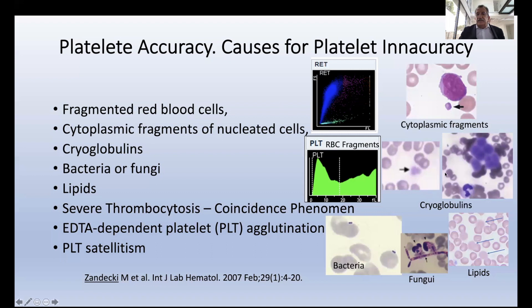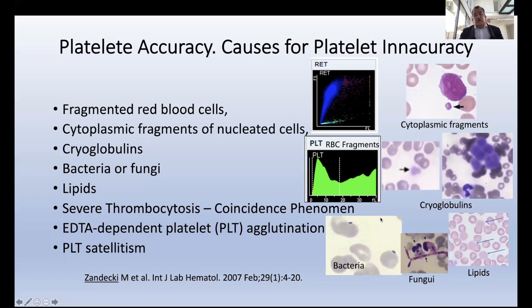Cryoglobulins can also interfere with the impedance count but not with optical platelets. Bacteria or fungi — you can see here diplococci that can be counted as platelets, and the spores of fungi can appear as platelets. Another possible interference is lipids: you can see in the blood smear particles of different sizes that can be confused with platelets. This happens in patients in intensive care or receiving parenteral nutrition.